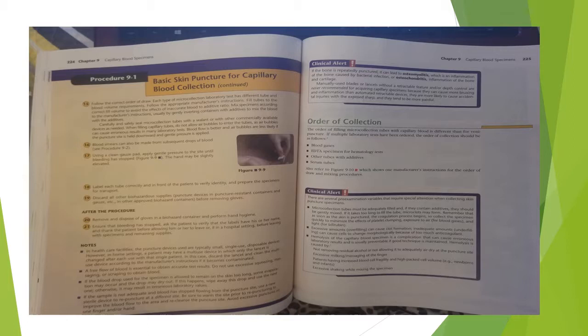Order of collection. The order of filling microcollection tubes with capillary blood is different than for venipuncture. If multiple laboratory tests have been ordered, the order of collection should be as follows: blood gases, EDTA, a specimen for hematology tests, other tubes with additives, and serum tubes. Also refer to Figure 9-10, which shows one manufacturer's instructions for the order of the draw, and mixing procedures.